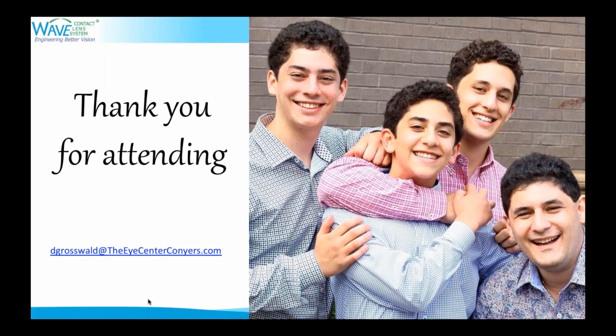Okay, thank you. Our next question, on average, how many visits do you save using the CSP versus empirical fitting with a diagnostic set? So over the years, at the very beginning, boy, because WAVE gives you, as a certified WAVE designer, 4 lenses before you get charged all over again, right? And so over the last several years, I can think of 1 or 2 times where I've had to jump into a 5th revision and pay again. And so with the Pentacam software, yeah, we're reducing it most often to about 2 lenses. I'm very persnickety, and just for a few extra bucks, I don't mind doing a 3rd lens, but it's usually me making the 3rd and 4th lens, because I'm adding a little bit of front surface toricity, or the lens might have rotated a little bit more.